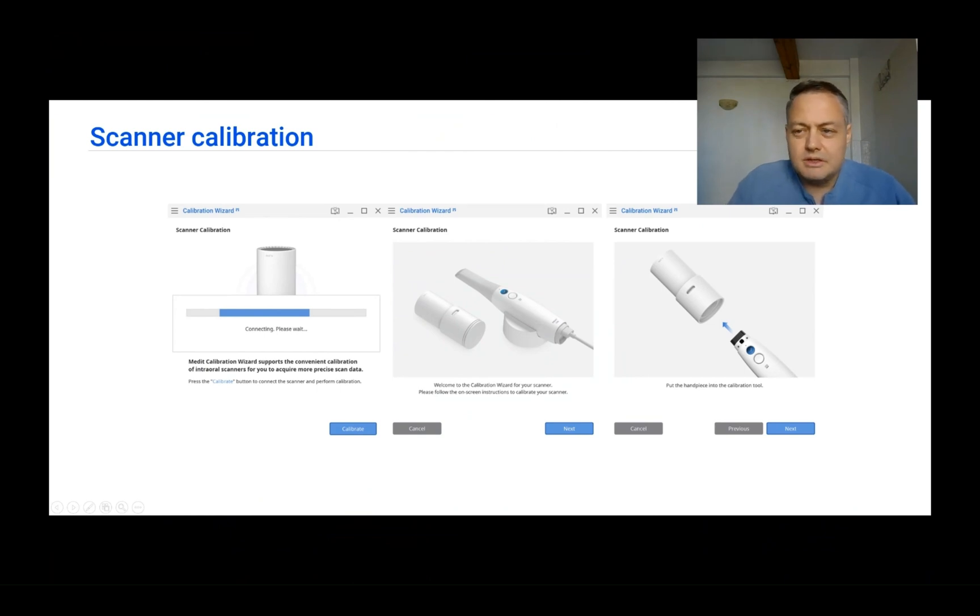Before doing your first scan, your scanner needs to be calibrated. The good part about calibration is that once done, the calibration data is stored inside the scanner itself, not the laptop. So once you have calibrated the device, you will be able to use it on any laptop — you do not need to calibrate for every laptop or desktop you use.